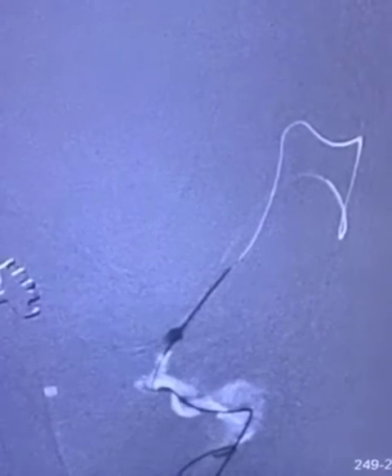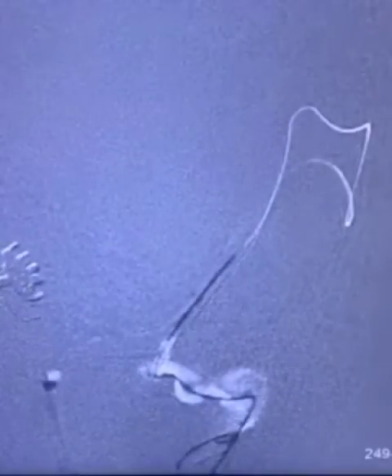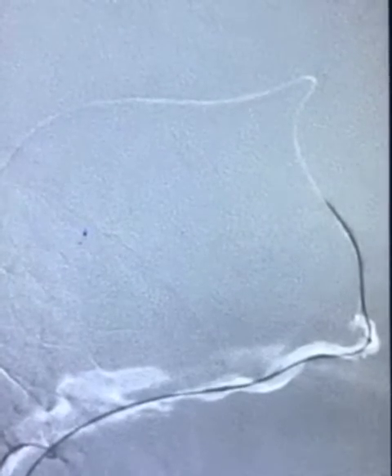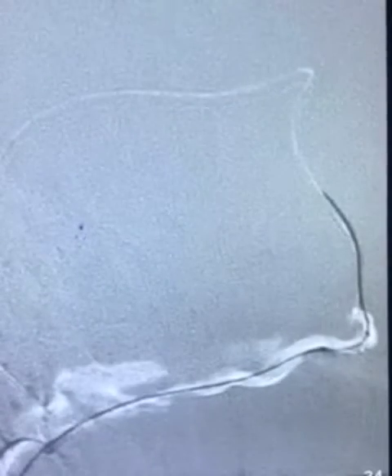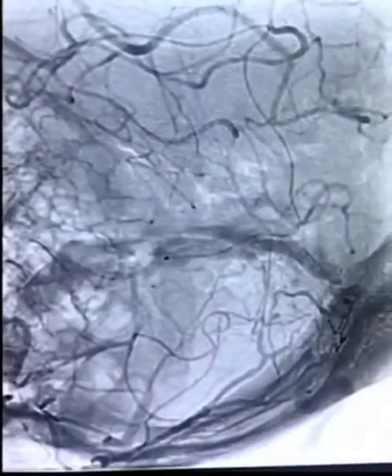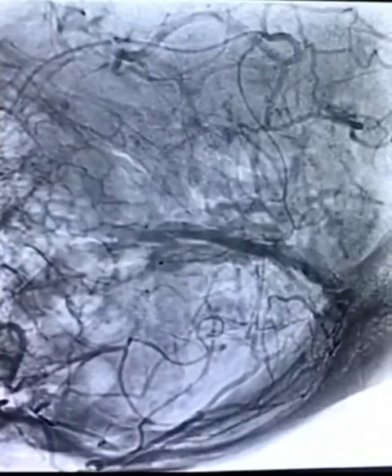When there are corkscrew-type vessels, we make a loop at the tip of the wire, take the guiding catheter as high as possible, and then navigate these loops with the wire. We position the microcatheter as close to the fistula as possible.